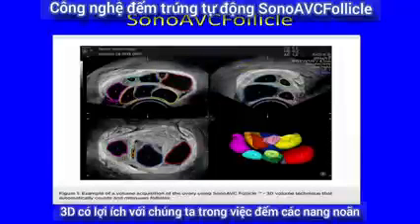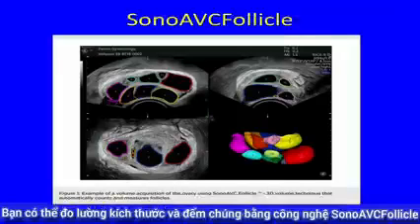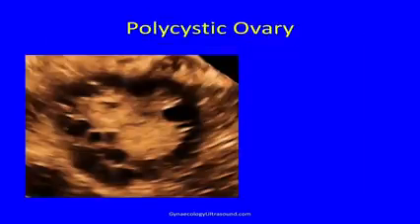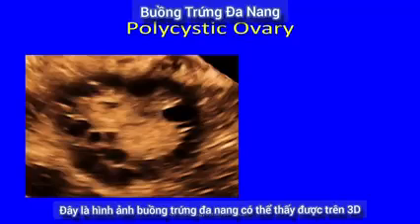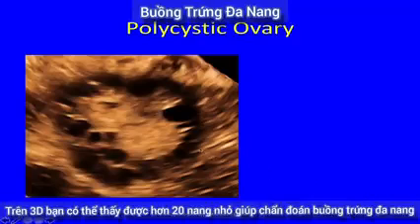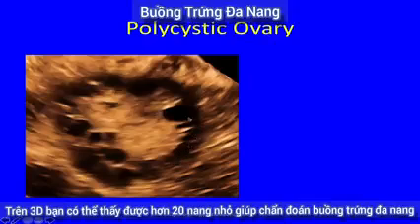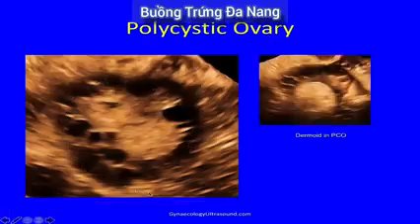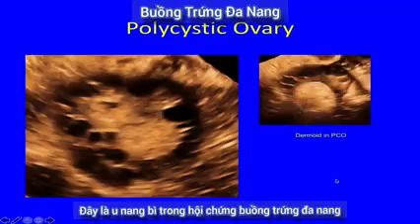3D is useful for follicle counting. You can measure and count follicles using SonoAVC technology. This is what a polycystic ovary would look like on 3D ultrasound, where you can now see more than 20 little follicles, giving you a diagnosis of polycystic ovary. And this is a dermoid in an ovary that is polycystic.